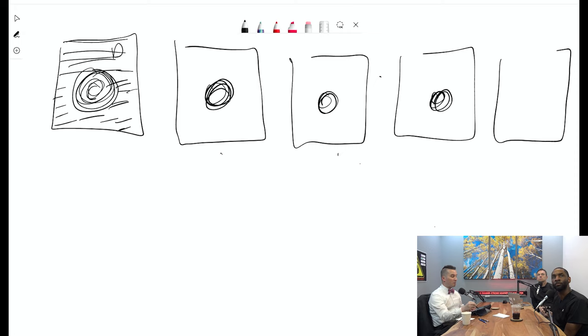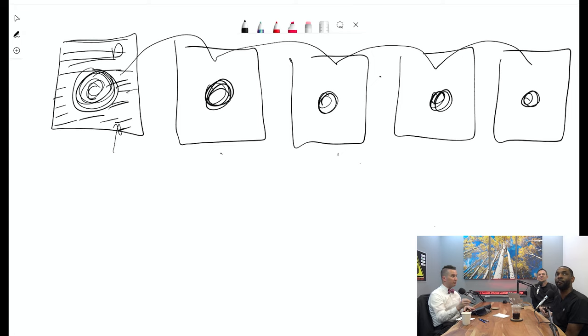But the problem is, what if this is the introduction to a temporal footprint? If the patient screwed the pooch during the pre, if something happened, that means we're copying and pasting bad periphery over every single one. If that patient had any motion, you are going to ruin every single other phase coming after it. So that temporal footprint on a regular keyhole filling is really dangerous. That makes sense?